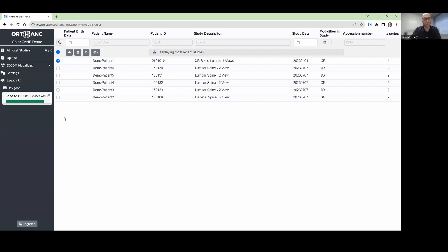At this point, these x-rays are being sent to a fully automated analysis pipeline that will identify the x-rays, label all the imaging, and calculate and report on a number of different results, including spinal motion and spinal alignment.